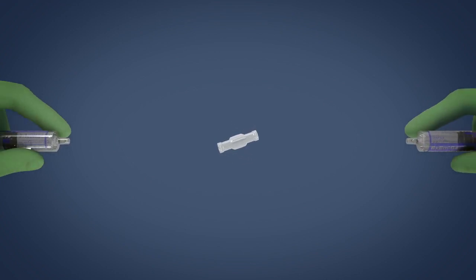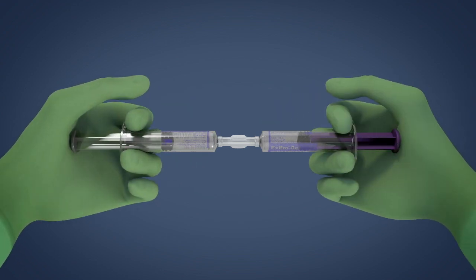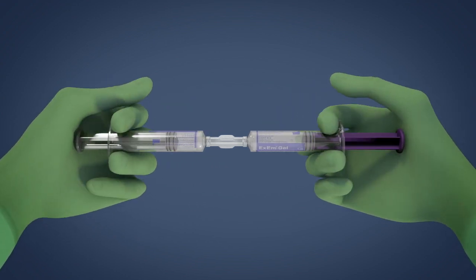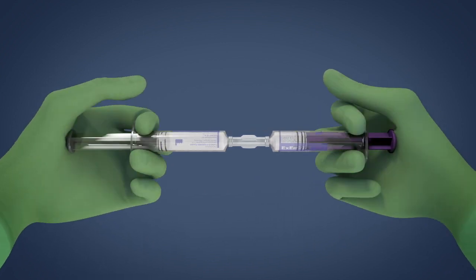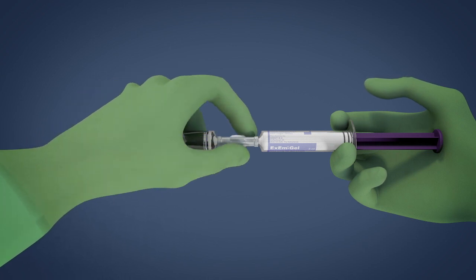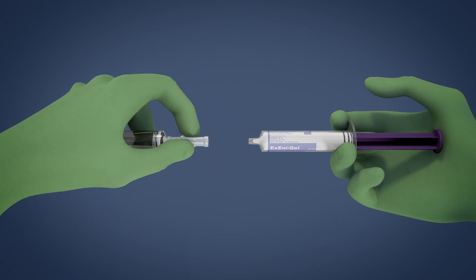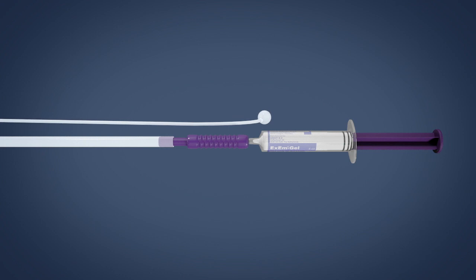Connect the XM gel and the XM water syringes to the coupling device. Mix the XM gel with the XM purified water by injecting the fluids from one syringe through the coupling device into the other syringe at least 10 times. This creates a milky white gel foam. Leave the gel foam in either one of the syringes and disconnect from the other syringe and coupling device. Connect the syringe containing the gel foam to the catheter.